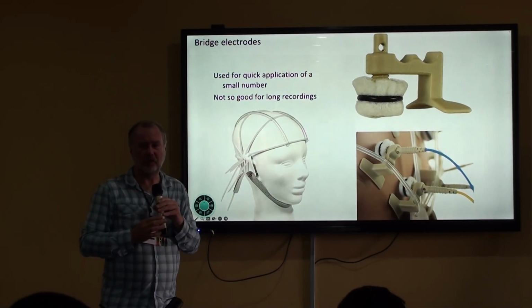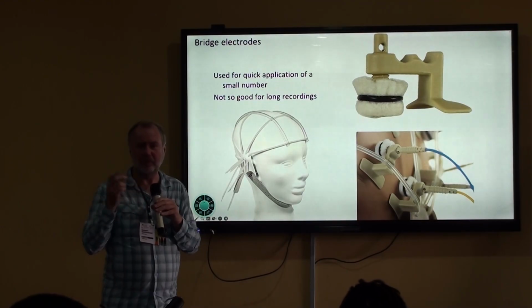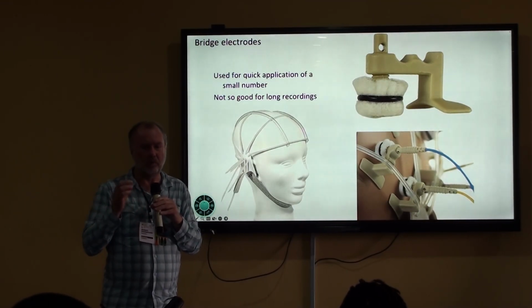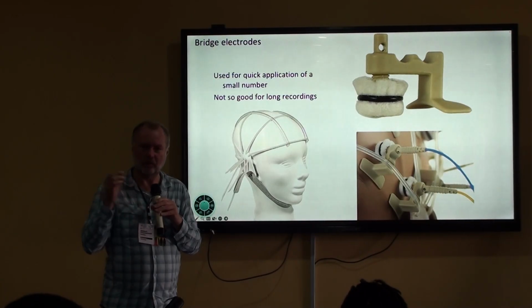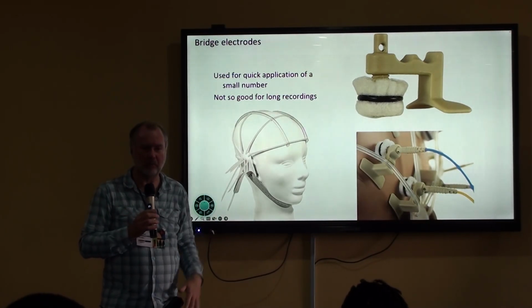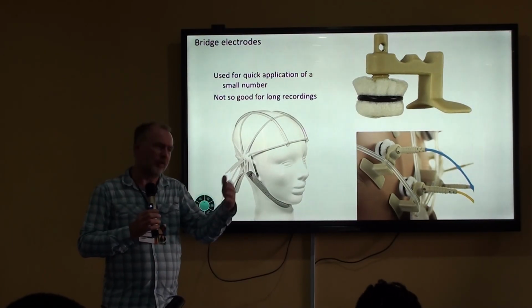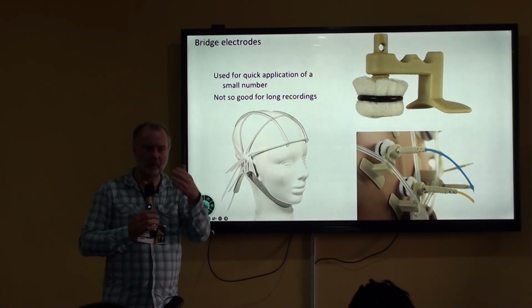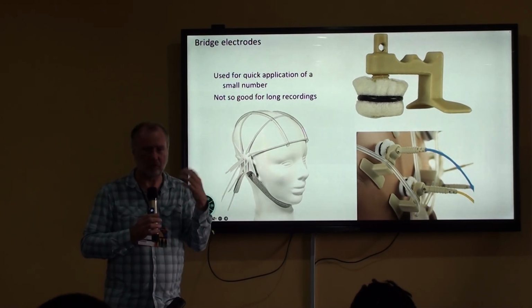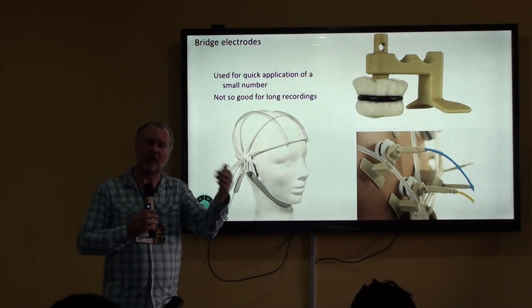I can show the features of one of the amplifiers that we have, because that amplifier can run in different modes. It can also run battery operated, and it has internal storage so that you can attach it to your belt or in a backpack in a similar way as I'm wearing this one now. And I think that would be relevant both for a Holter type system or for a remote monitoring system, so that if the wireless connection gets lost shortly, as happens here quite a bit, you would still want to store the data.